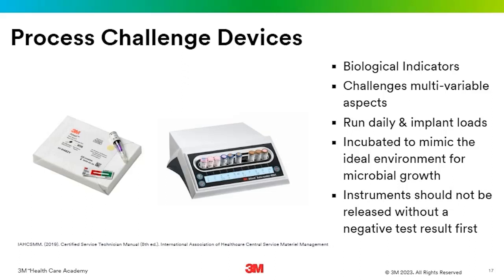Okay, so the purple inside of this ampule, I like to refer to it as like a food, right? It's like a food source. It's its medium that's going to help it grow. And that's why we use incubators as well. We use incubators. It's that nice, dark, warm, ideal environment where spores like to grow, and we're giving it its medium, its purple food, dare I say. And we're going to run it in the sterilizer.